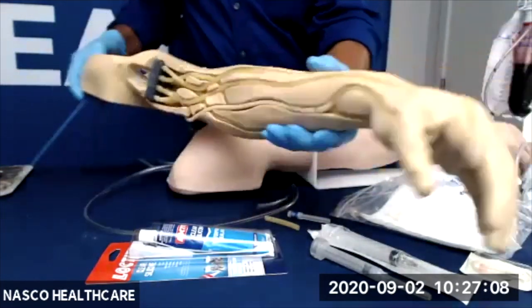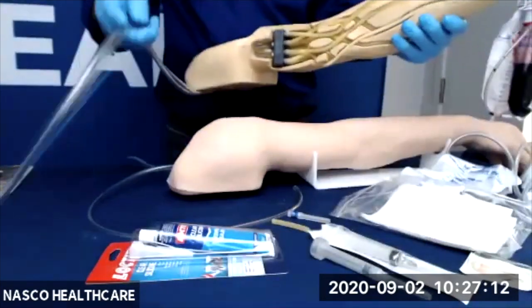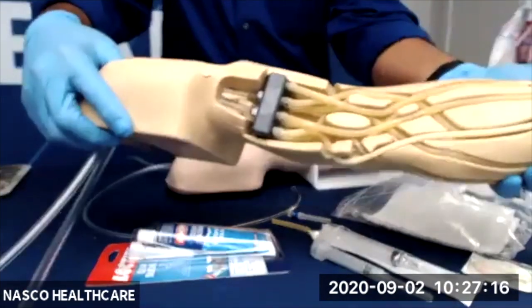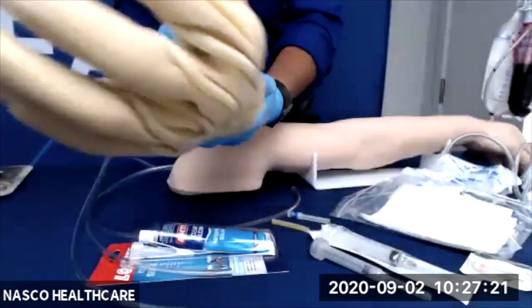Also new is the inclusion of a small floating vein. Khaled will show us this small floating vein, which is used to practice rolling and disappearing vein access for difficult vein scenarios.